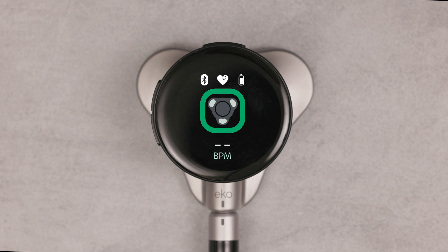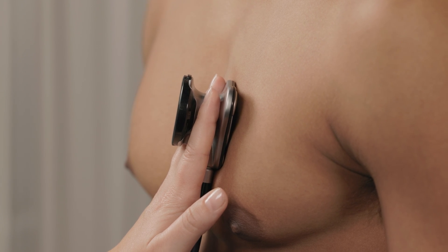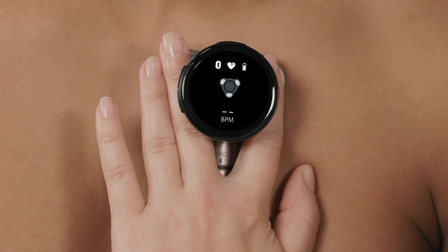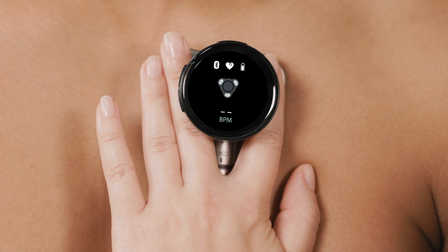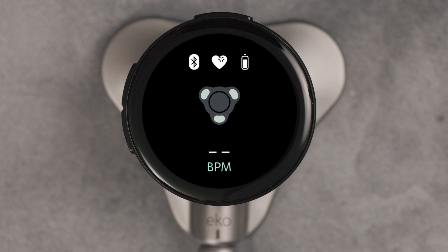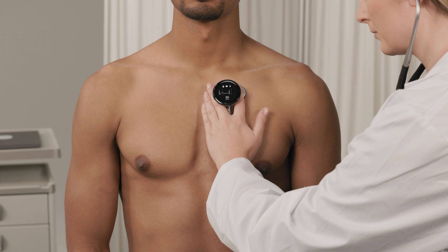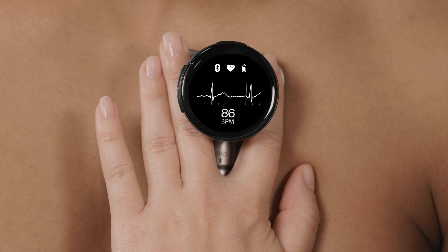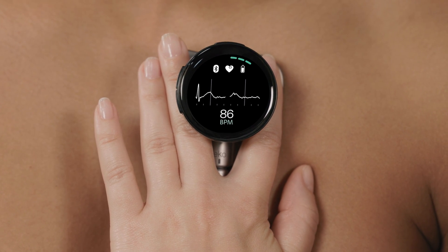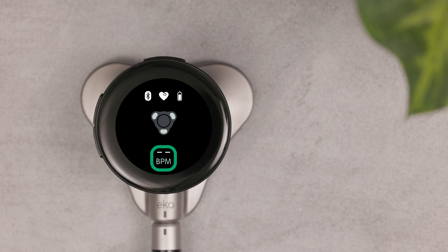ECG recordings require contact with skin. If the electrodes don't make contact with skin, the lead indicator is gray. When they do make contact with skin, the lead indicator turns green and has a check mark. Place the device on the skin. When you get a good signal, the screen shows the heart rate and ECG waveform. At the bottom of the screen is the heart rate in beats per minute. If the rate can't be detected, two dashes appear instead.